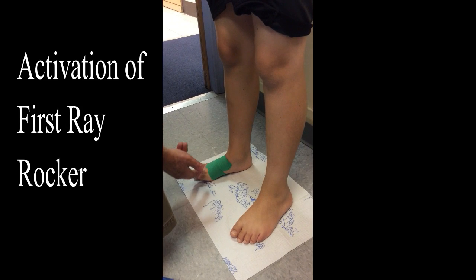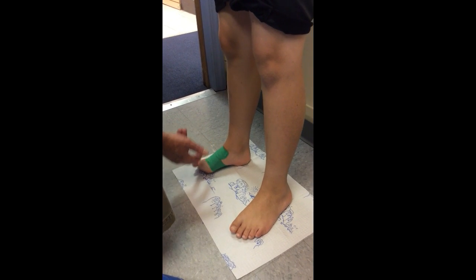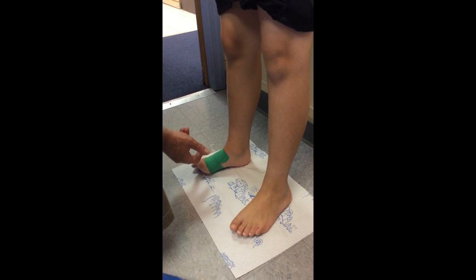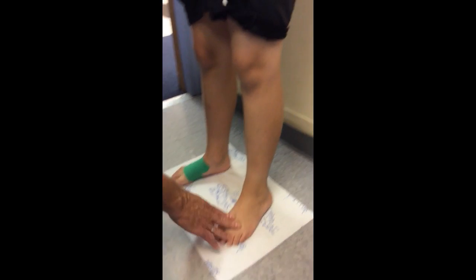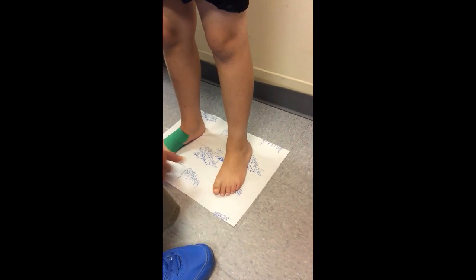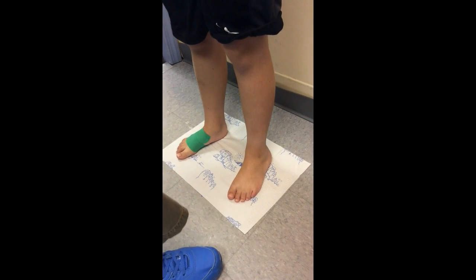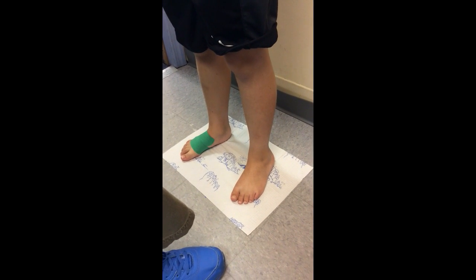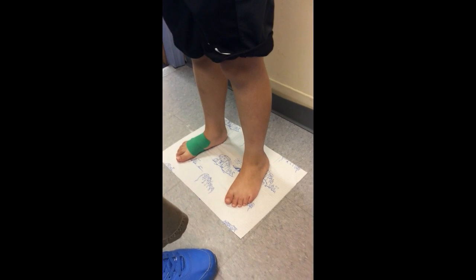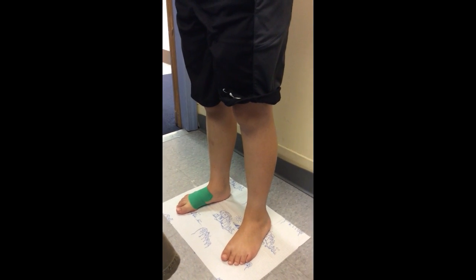This is now coming off the ground as a unit. I have activated his first-ray rocker, his subtalar joint, and his leg muscles, so that he's working on this other side. I can push and push and push — when I push, I'm activating every muscle that's not working. He's going to get stronger and literally, little by little, be able to correct his foot type.